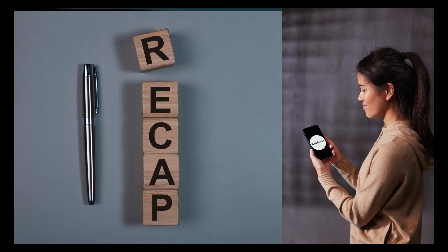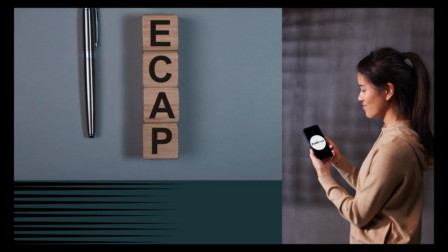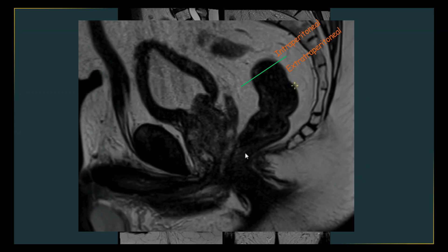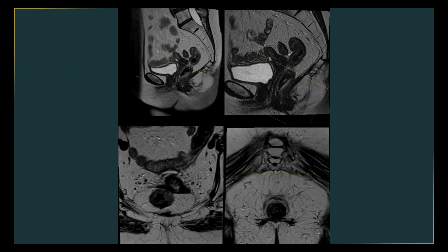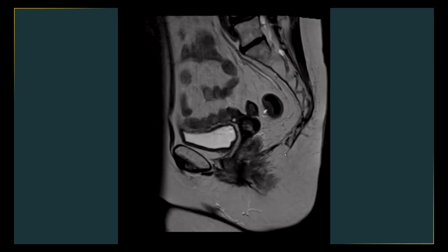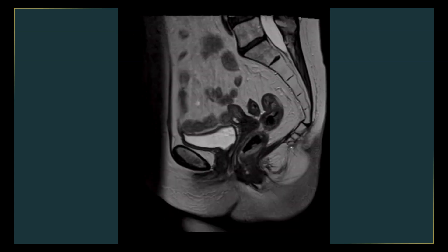Let's quickly first recap what we learned about anterior peritoneal reflection. As we discussed previously, this is a thin layer of visceral peritoneum which plays a key role in separating the rectal intraperitoneal and extraperitoneal parts. In our last video, we saw how the peritoneal reflection can be identified on the sagittal images in male patients just above the seminal vesicles. In females, the peritoneal reflection is identified at the level of the cul-de-sac or pouch of Douglas.